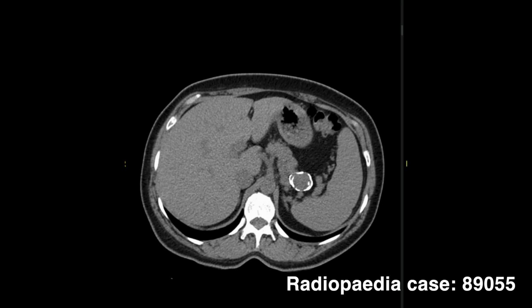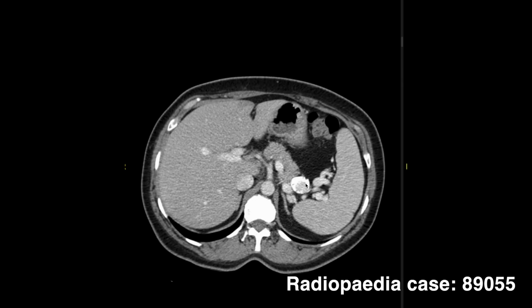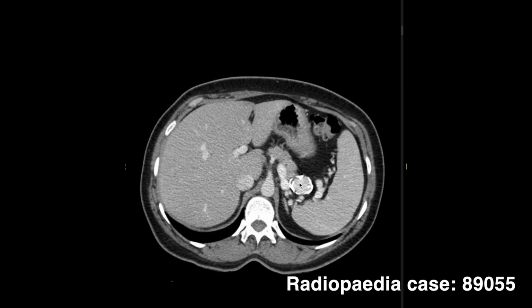Patient with non-necrotizing pancreatitis brought back for the scheduled follow-up CT, feeling okay. Actually, I am doing my usual sweep, pancreas, collections, biliary. Wait, stop right here, exactly at the tail. See that round structure? Let me put a measurement on it. It is around 3.2 centimeter. What is the density?